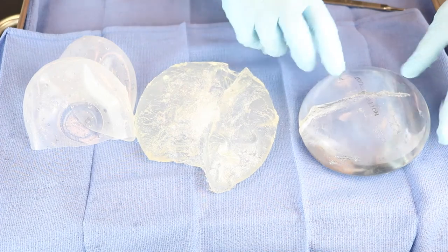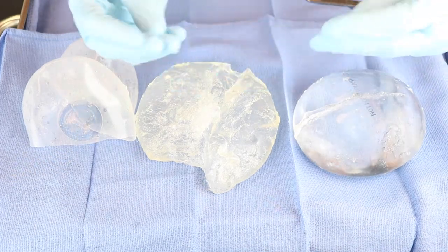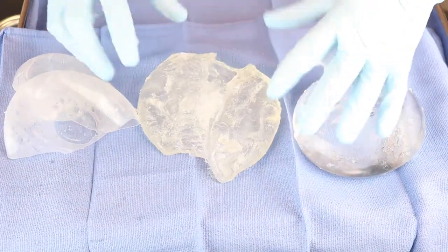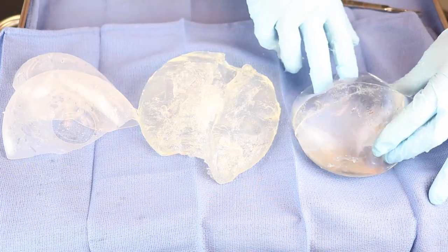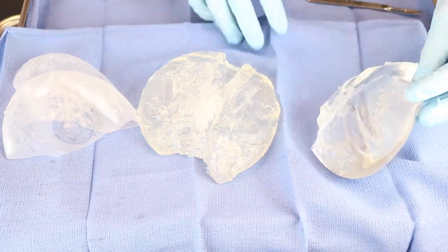So there you have it. We have our form-stable, cohesive implant that stays still, our saline implant, and then the older silicone implants — which I do not use in my practice and I don't know anyone who does. You can see why I believe the newer implants are much safer and hold their shape much better over the long run.